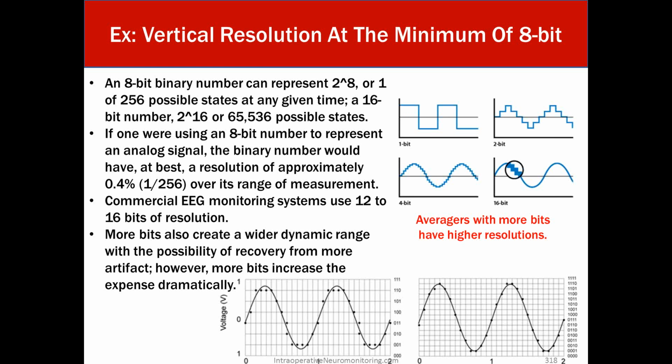Commercial EEG monitoring systems use 12 to 16-bit resolution. Remember those numbers, 12 to 16-bit resolution. More bits also create a wider dynamic range with the possibility of recovery from more artifacts. However, more bits increases the expense of the system dramatically.